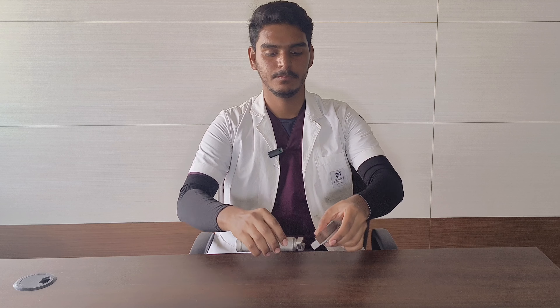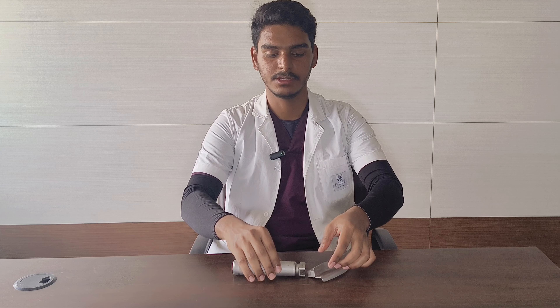I will gently push it down — this is how you disassemble the laryngoscope. Now I am going to tell you the indications of laryngoscopy. What are the conditions when we are going to use the laryngoscope? As I said in the previous part, laryngoscopy is the endoscopy of the larynx, which is a part of the throat. So any pathology related to the throat and the upper airways — we are going to use the laryngoscope.